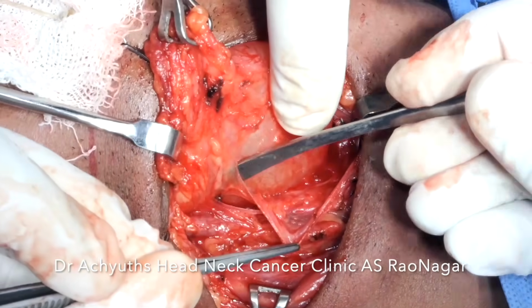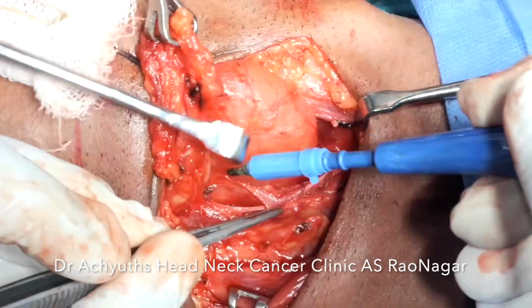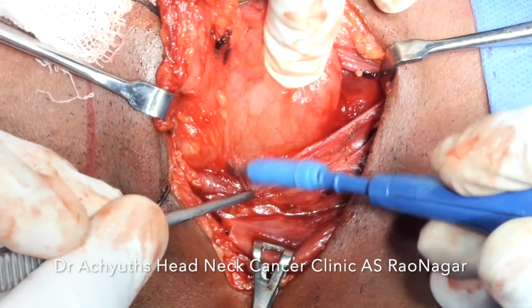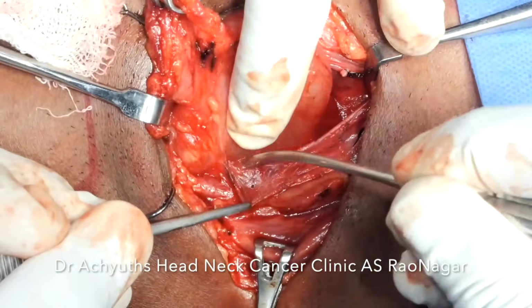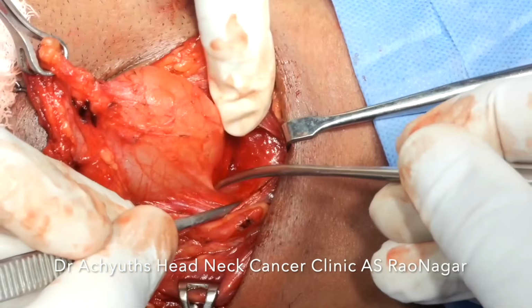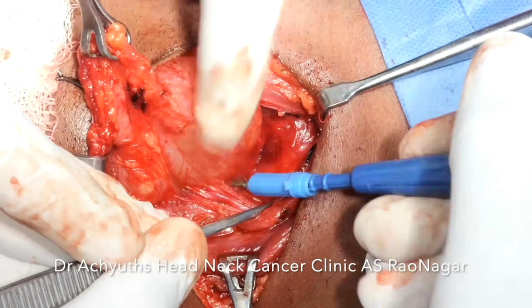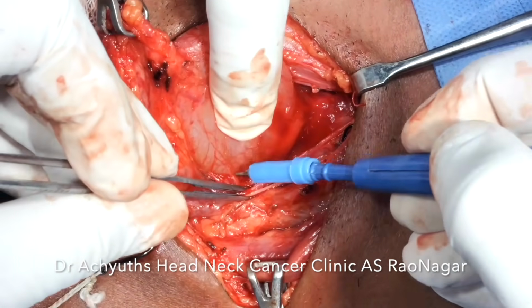So with the dissection with the help of a tonsil elevator, monopolar cautery and bipolar cautery combined, mix and match, the only idea of using all these instruments is to safely separate the cyst wall, that's all. Now here we have seen dense attachment of the muscle fibers with the cyst wall, but luckily we could dissect it away without damaging the cyst wall.